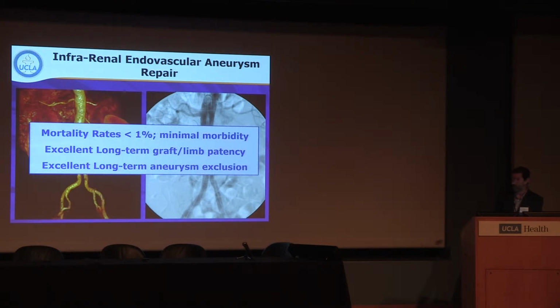And these days, with the current technology we have, you can expect that patients with good anatomy will be able to undergo these procedures with mortality rates less than or around 1%, excellent long-term patency of the graft limbs and the graft itself, with excellent long-term aneurysm exclusion.